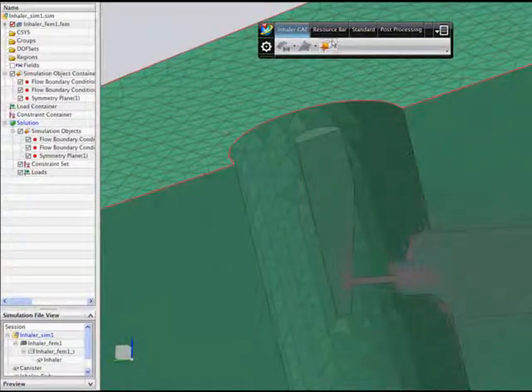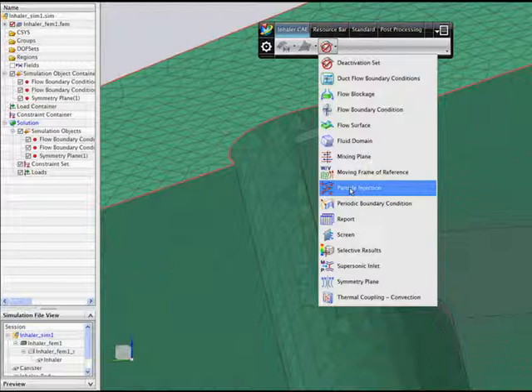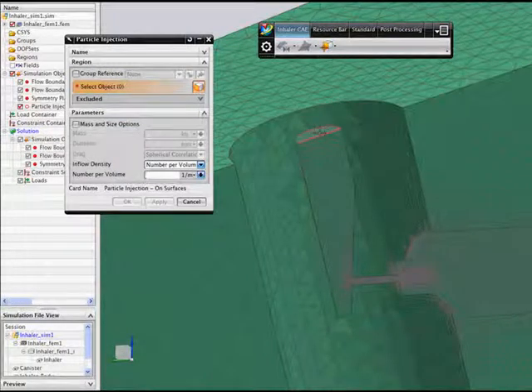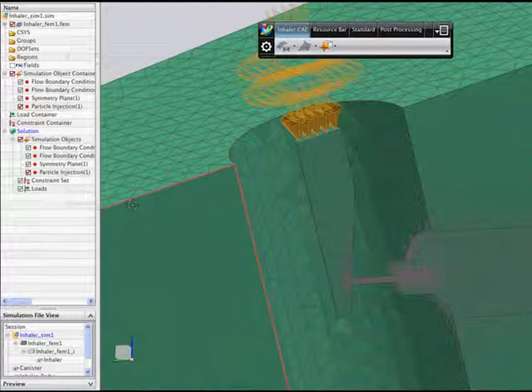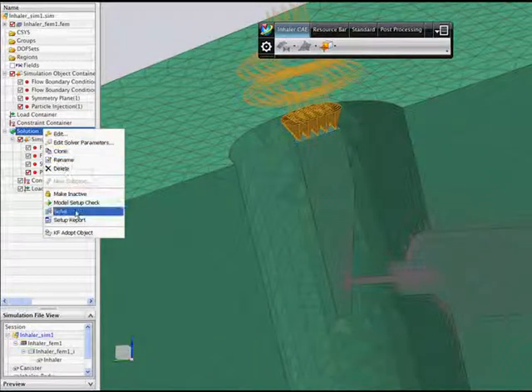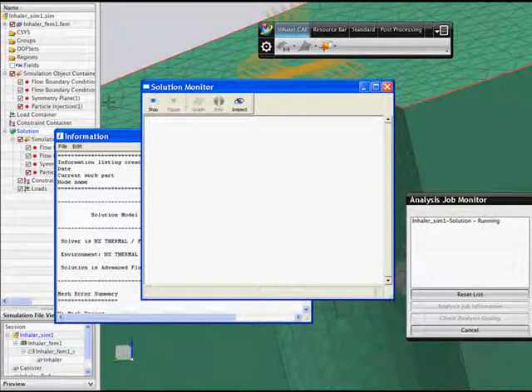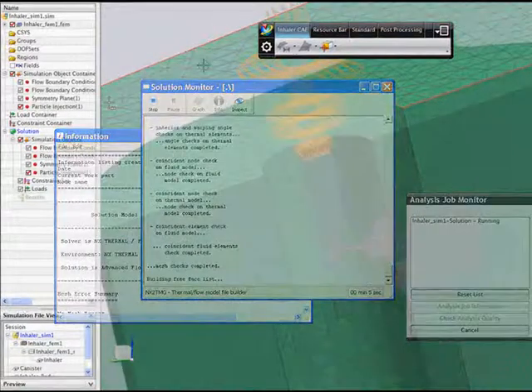To evaluate how effective the injector nozzle is at dispensing medication, you can use particle tracking. Injecting a certain number of particles at the injector inlet allows you to detect where these particles are discharged in the inhaler assembly. The analysis model is now complete and ready to solve. As the solver runs, you can monitor its progress and track convergence of the flow equations.